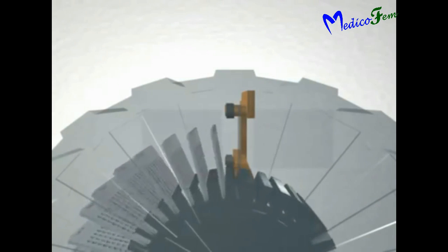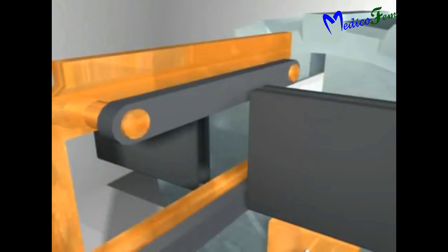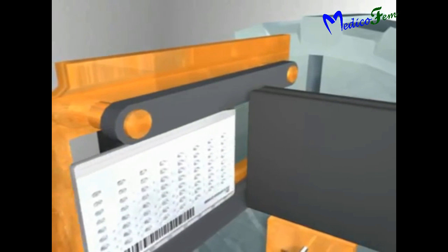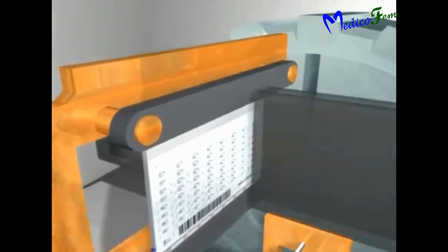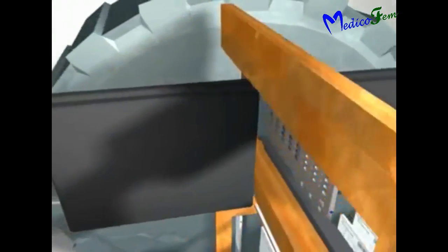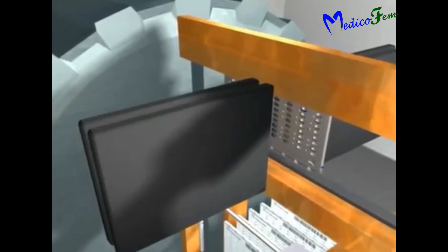At every 15 minutes, each card comes to the colorimetric scanner for scanning of color development that occurred due to biochemical reaction or sensitivity in the card.